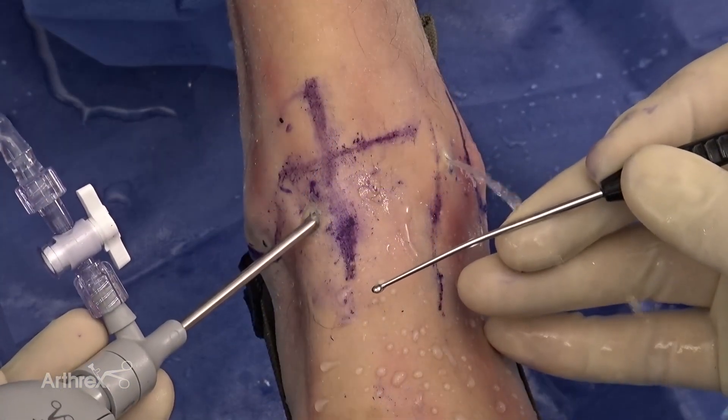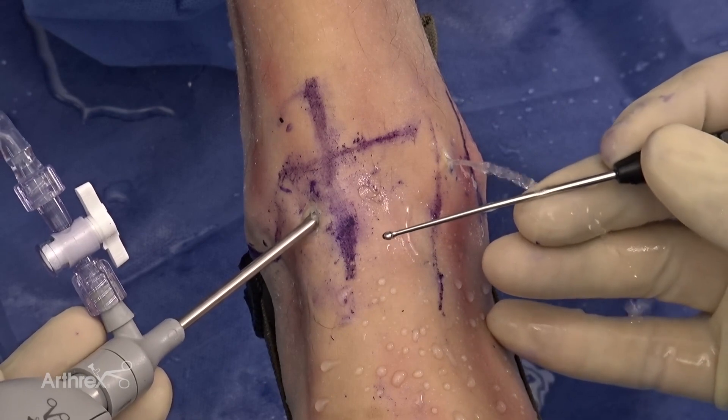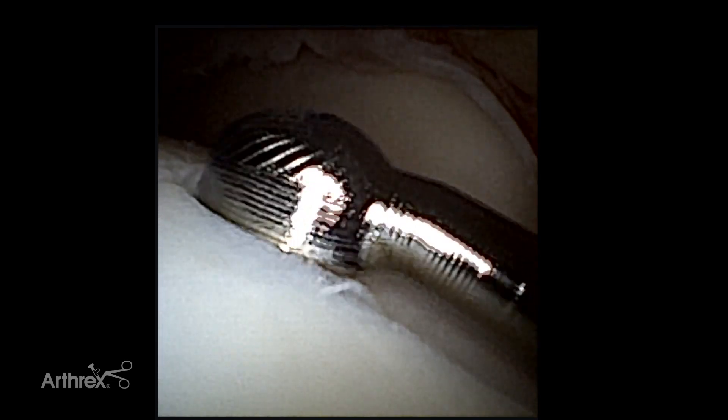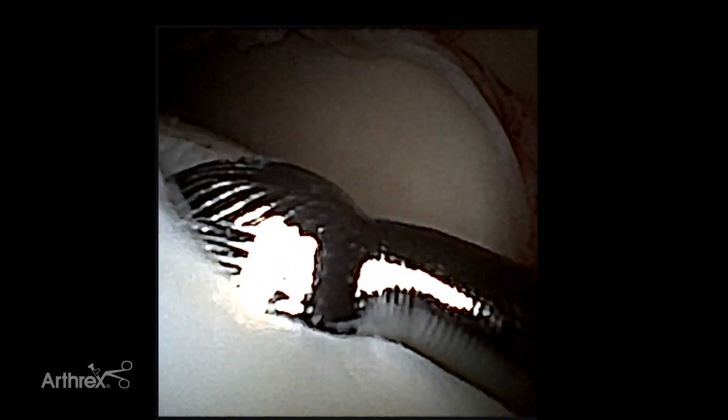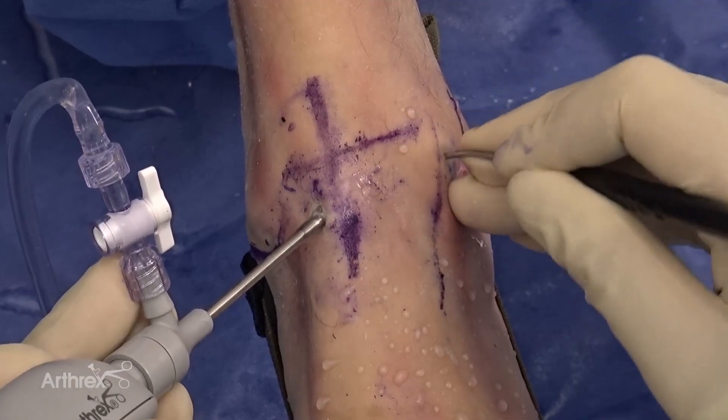Utilizing the reusable bending instrument, we're able to bend the distal tip of our nano ring curette or nano cup curette to better address the chondral pathology. Entering the ankle now, we can achieve the angle we want to create the sharp borders we desire, allowing us to create a better healing environment for the osteochondral defect. We get down to the bone and perform a nice abrasion of the calcified cartilage layer using the angled cup curette to prepare the base of the lesion.